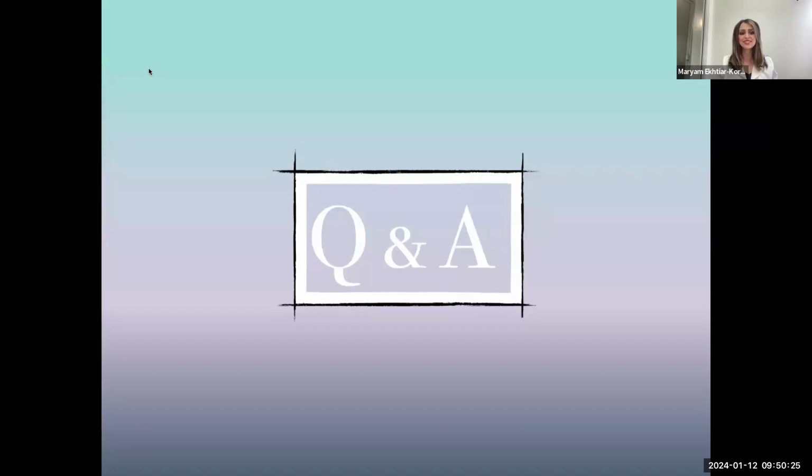Okay. Lot of questions about the material camouflage that you talked about. So, first thing is shade. What shades does it come in? How do you select the shade? Well, I like to have my own. I have an arsenal of shades, and as you saw with the boxes that I have A1 through A3, and there's high and low translucency.